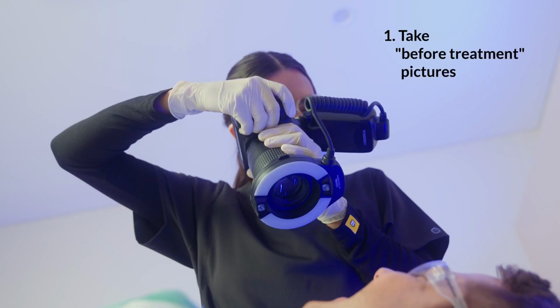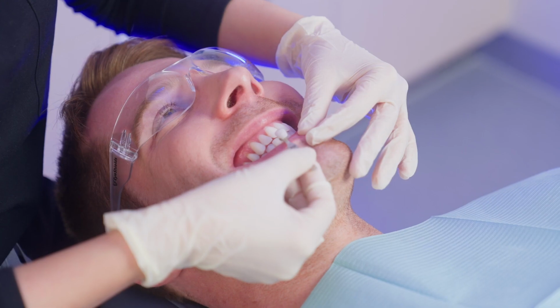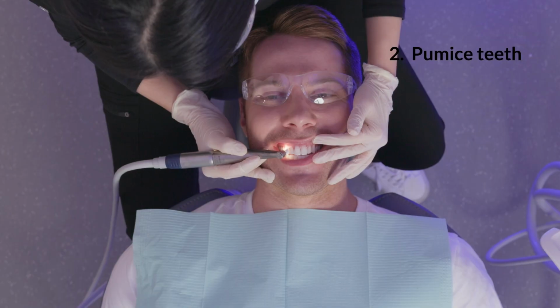Let's get started. Step 1. Take pictures of the patient's smile with and without the starting shade tab in the photo. Step 2. Use fluoride-free paste to pumice the patient's teeth. It's an important preparation step for best results.